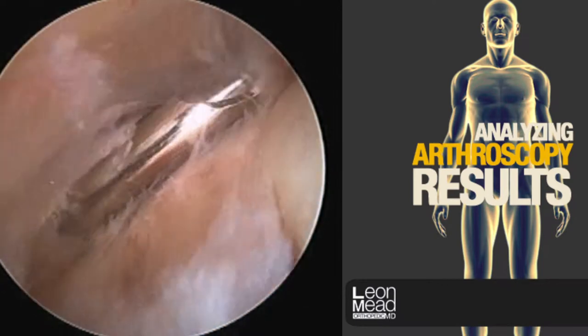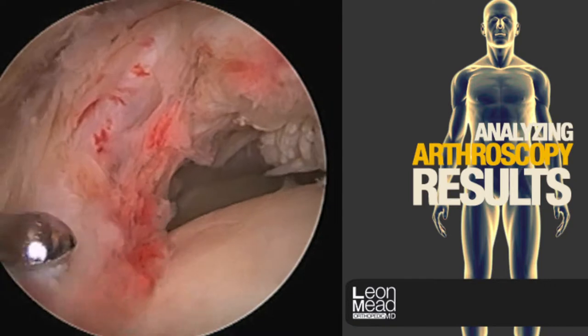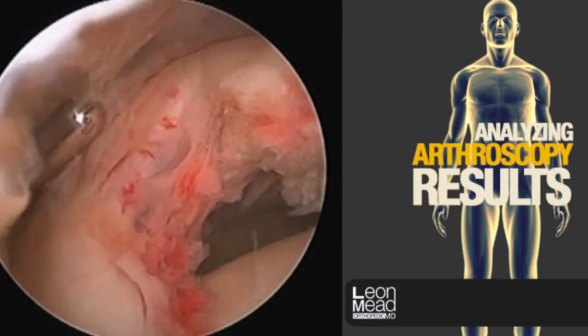As you can see, in some areas it becomes quite thickened and can sometimes masquerade as the rotator cuff. So it's very important that this is removed. If it's inadvertently confused with the rotator cuff, the repair will fail.